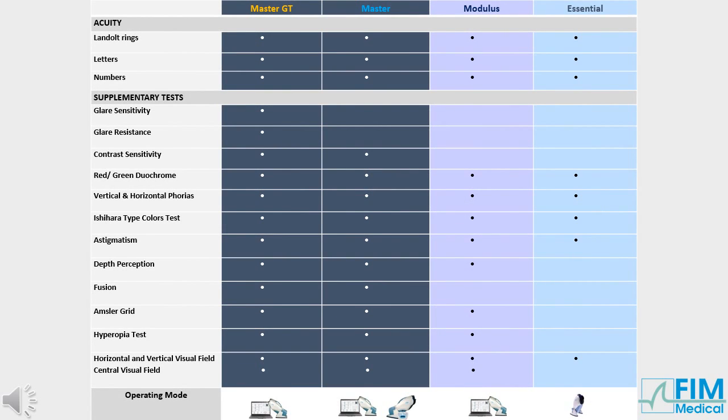The VisuLight Master GT is a computerised model that offers all tests. The VisuLight Master is operated by software or remote control and offers all tests except glare resistance and sensitivity. The VisuLight Modulus is operated by software and offers fewer tests than the Master model. The VisuLight Essential is a user-friendly, remote-controlled version that offers the main tests used by occupational health centres.